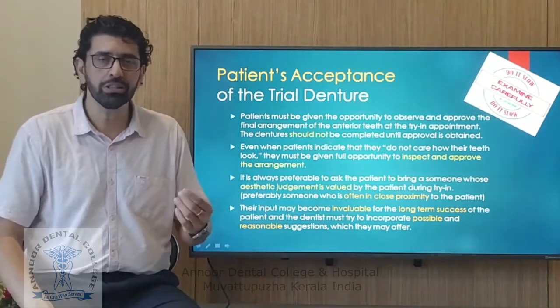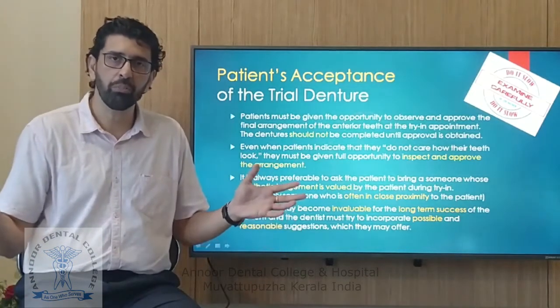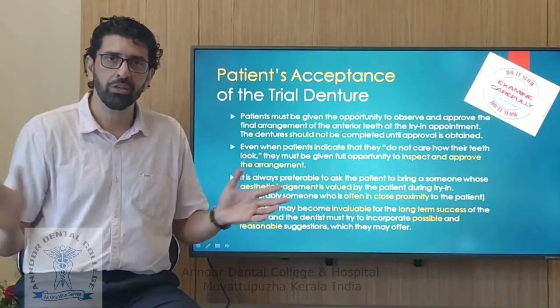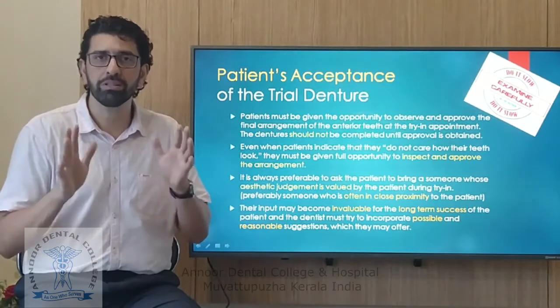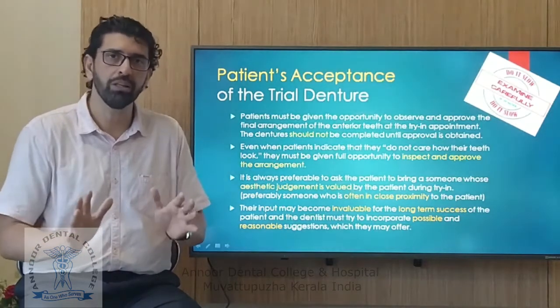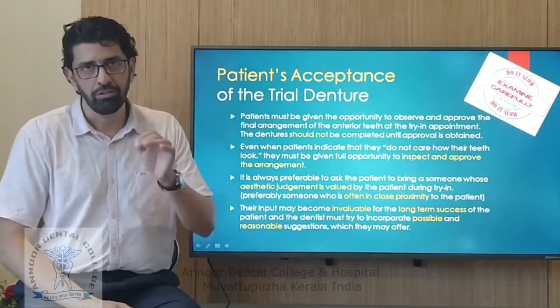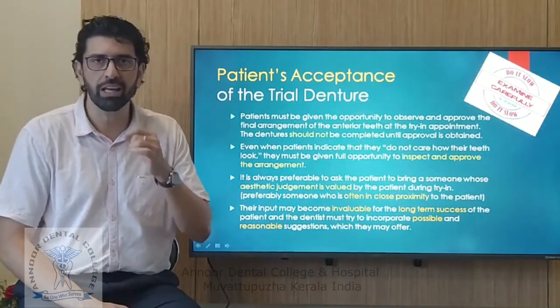And you're just going to deliver, insert the denture, and forget about it after a couple of post-insertion recalls. So for this reason, make sure the patient has a final say and the patient is happy with the trial denture before you quit the try-in appointment. When you get the approval, make sure you get it on pen and paper. Make sure you get it signed.